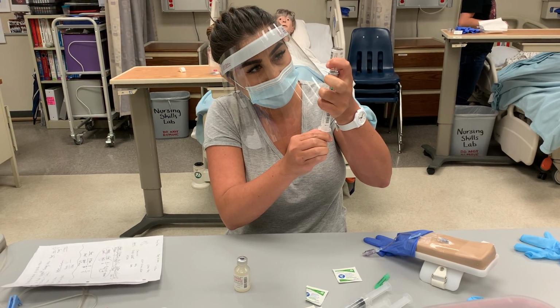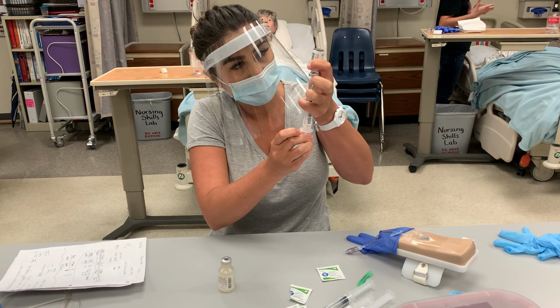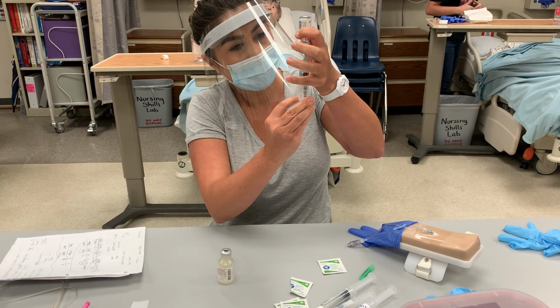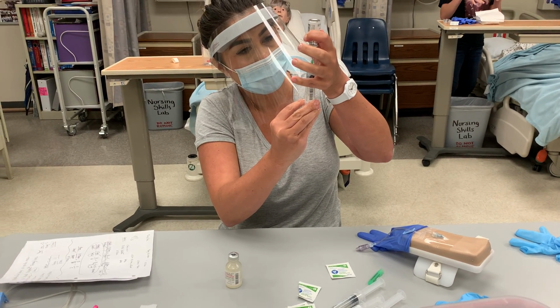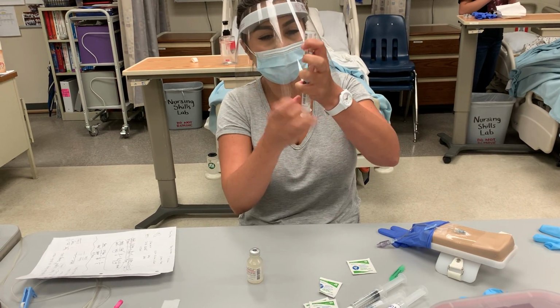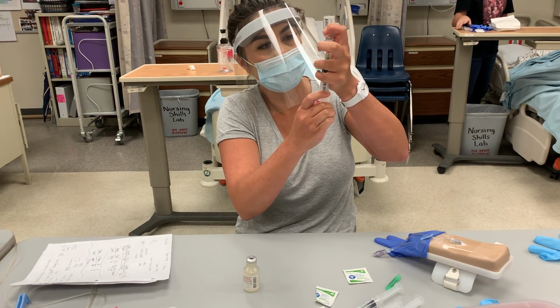And I need a lot of resistance. I don't think in real life that would happen, just because these have been used a lot. Okay, so I'm going to push back a little. A little bit more to get the air out.